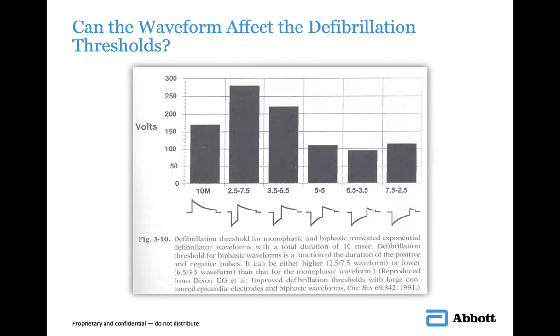Thank you very much, sir. This raises a need for one or two clarifications, if you won't mind, sir. Yeah, no problem. Please go ahead. The first one: how many cycles of defibrillation are we allowed to do for us to call it failed defibrillation or failed cardioversion? And the second question: when you have failed defibrillation, what do you do next?